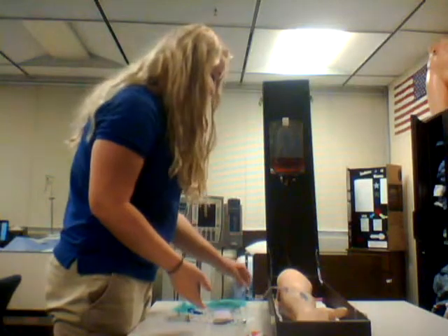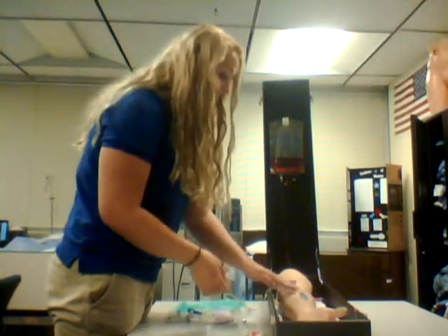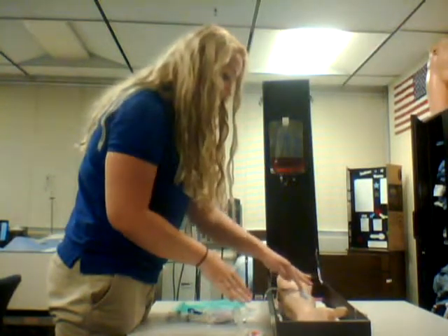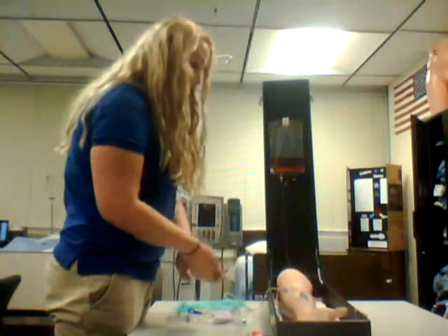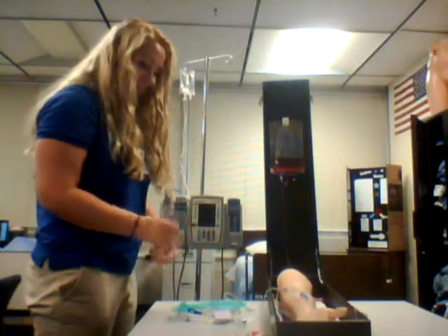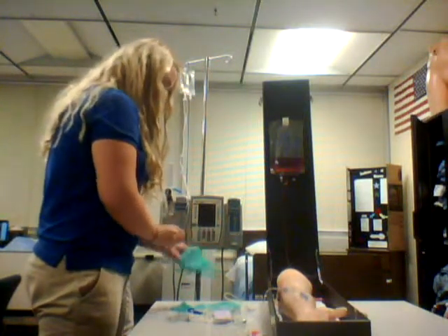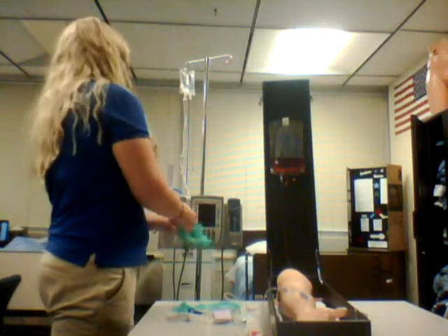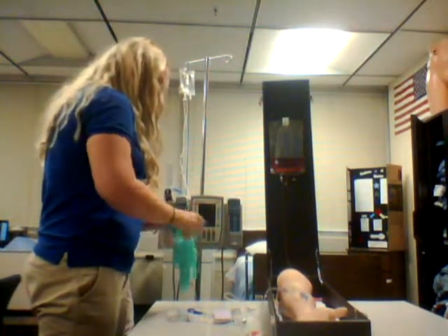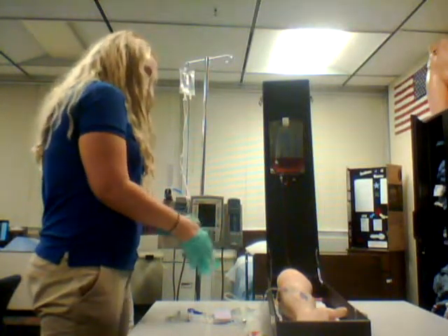So I'm going to assess the IV site, and I'm going to be looking for any phlebitis, pain, tenderness on palpation, pain, edema, and I see that there is none of that. So then I'm going to put on my gloves. There you go. Okay, so now I've filled my chamber here, and I can go ahead and actually prime my line.